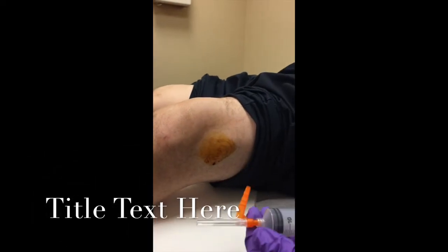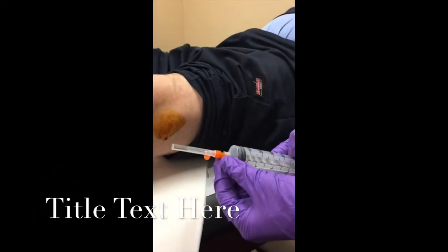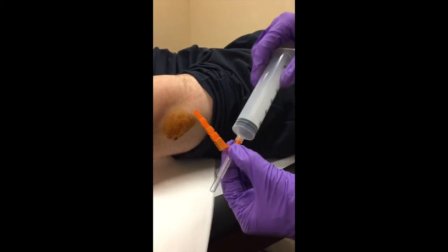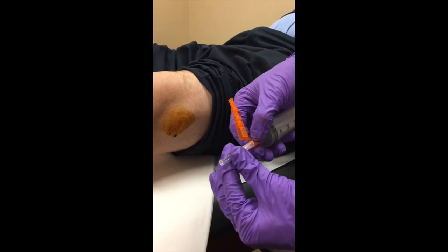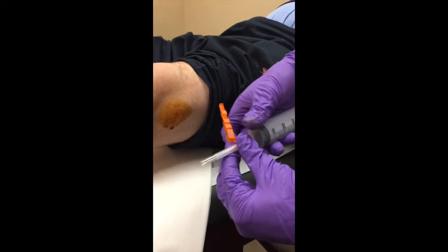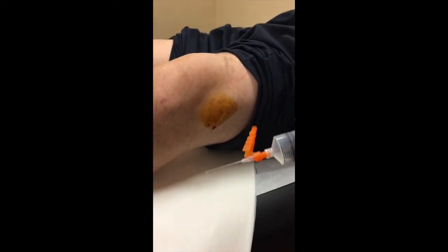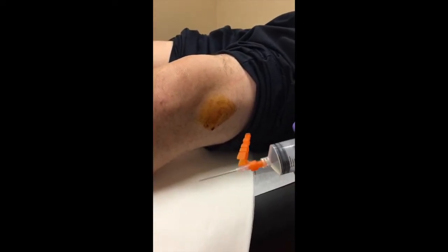A technical pearl: make sure the orange safety cap can go on and off pretty easily, but also make sure the needle itself is screwed on quite hard so it doesn't fly off. Take the 18-gauge needle and confirm you can move air in and out freely.